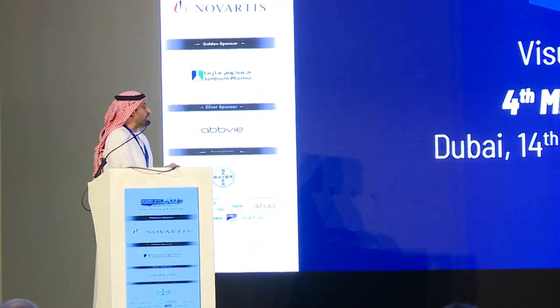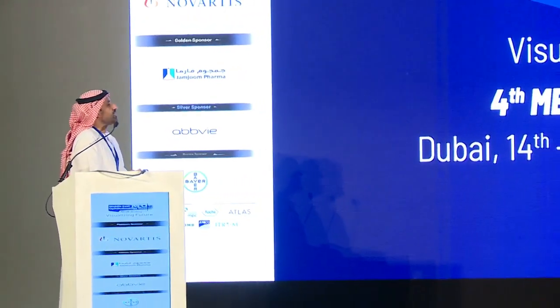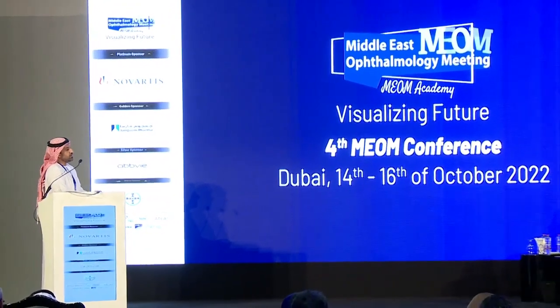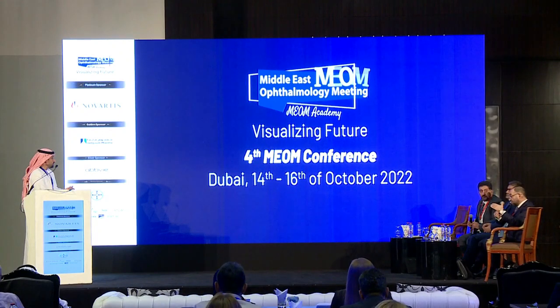I personally don't practice epi-on in these patients, I always practice epi-off. Yes, we are talking about classical epi-off, and 6 months. Now I'm waiting for 1 year, and I have had a patient with regression after 1 year. Well, I agree. Cross-linking is successful in 93% of patients if we follow them up to 7 years. 7% will still regress, especially those with low age, from 20 to 25, who have a higher chance than others.